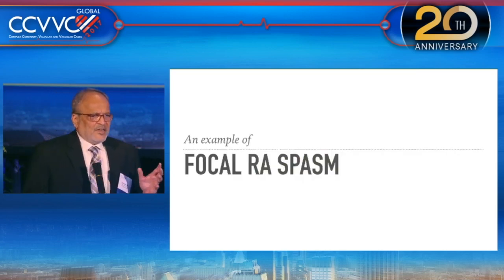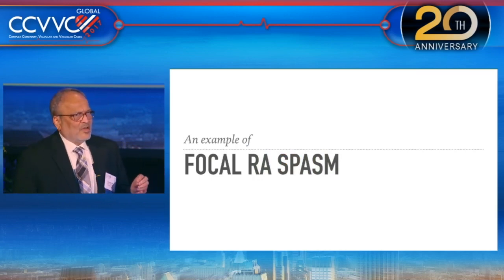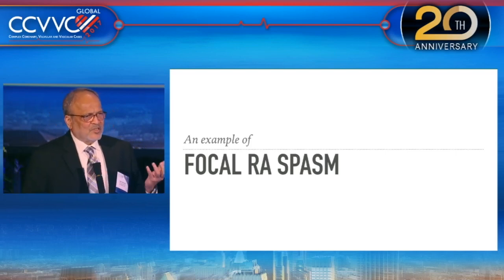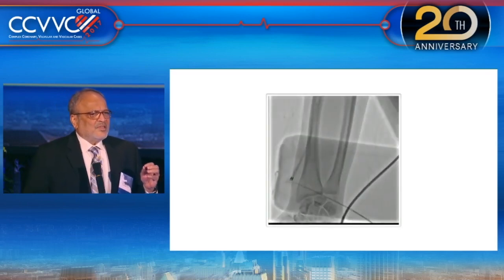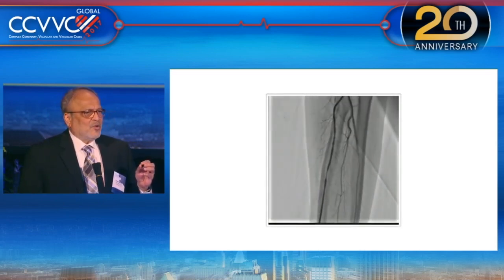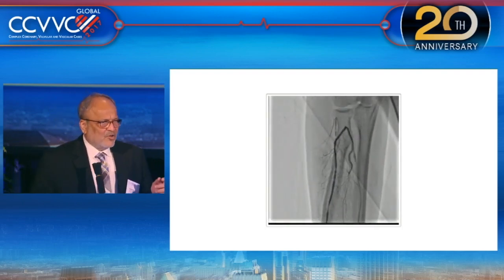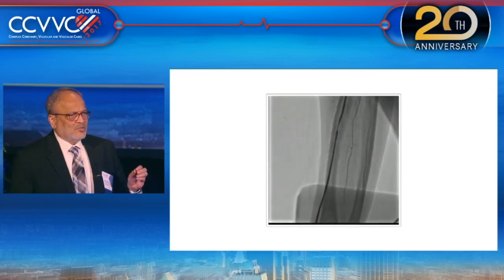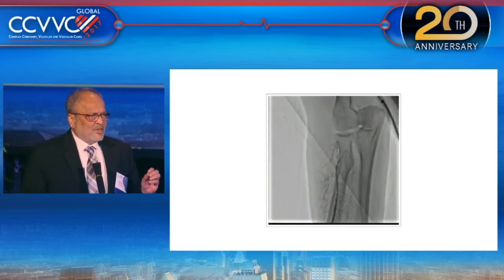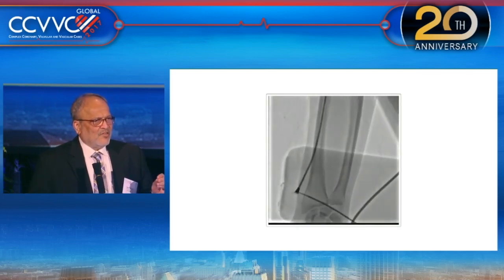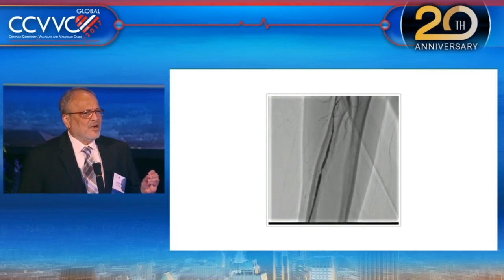Focal radial artery spasm is a problem for any beginning radialist. It can happen with intermediate experience or even the most experienced radialist. Whenever you experience resistance with your wire or catheter, you have to inject and see the reason for it. Diluted contrast was added to the nitroglycerin and verapamil combination, and you can see how the spasm disappears.